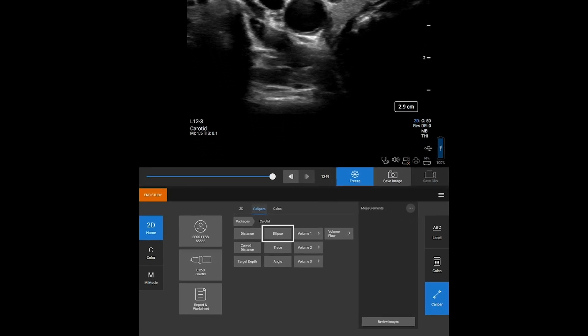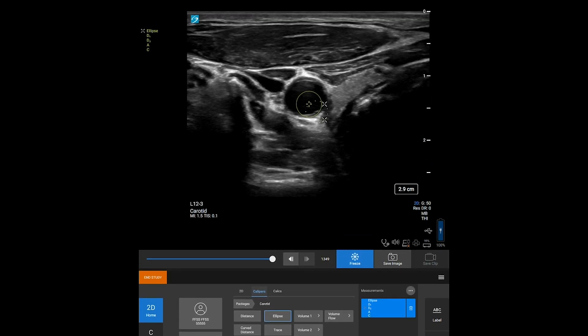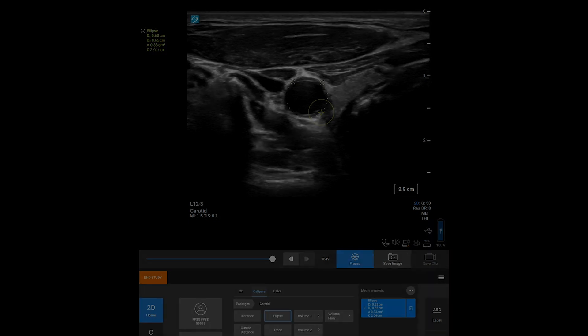To measure circumference and surface area, tap the ellipse measurement. Position the first caliper on the touch screen, then tap the second caliper to position it. Tapping either of the calipers again will allow you to reshape the ellipse.